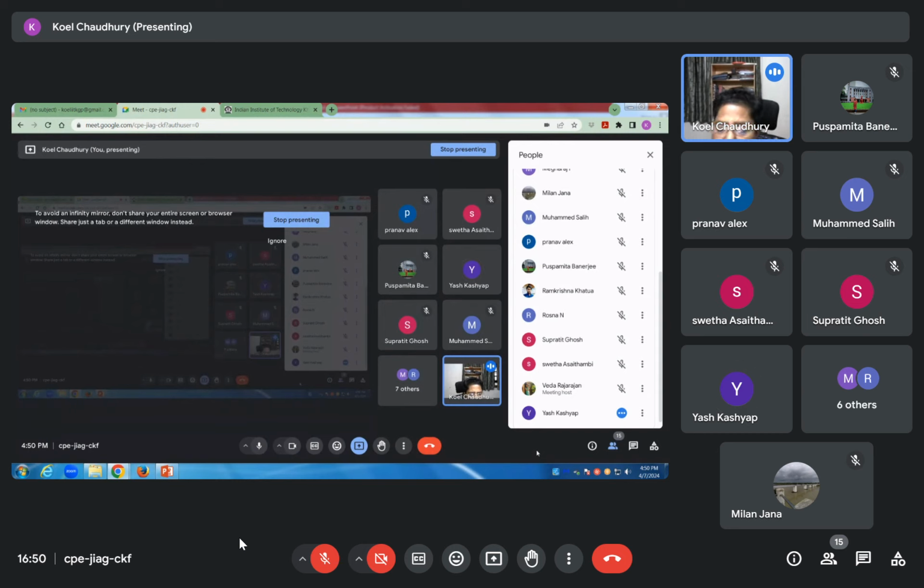Then there is a little bit of a gap, and then you have another term. What is it called? Time of repetition. The next pulse of radio frequency is given, very good. And again the process of dephasing and rephasing continues. So again at TR you will have a 90 degree. Again at TE by 2 you will have a 180 degree. Again you will have another time to echo. Again after some time you will have the second TR.